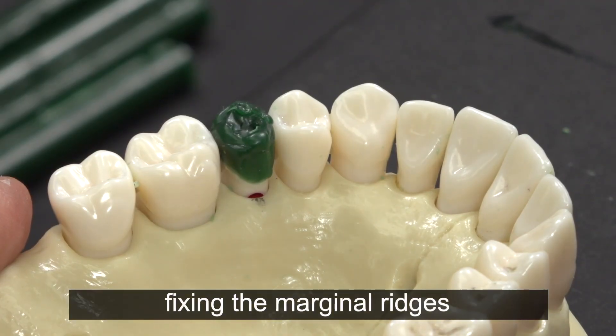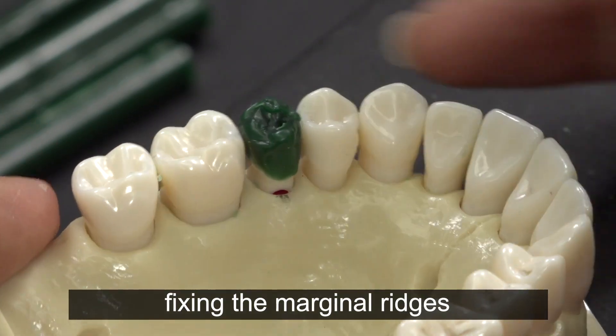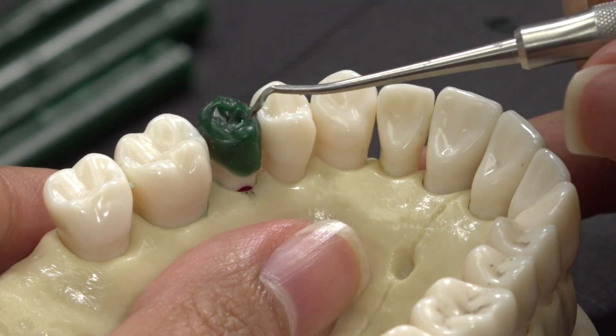I now notice that my marginal ridges are still too high, so I use carver number 3 to bring down the marginal ridges and create a fossa at the same time. This will also help shape the cusp tip and create a diamond shape.